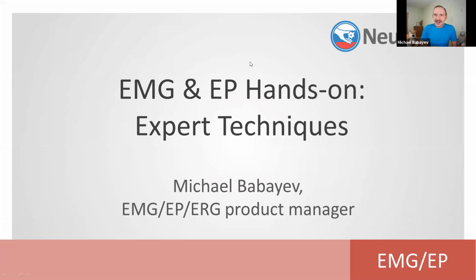Good day, ladies and gentlemen. Now we begin our third series of EMG and EP webinars. And today our theme will be EMG and EP hands-on expert techniques. My name is Michael Babayev. I am EMG, EP and ERG Neurosoft company product manager. Let's get started.